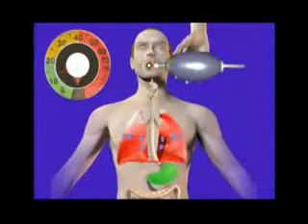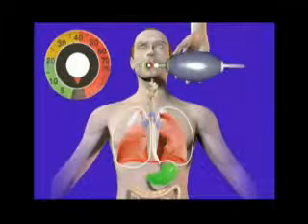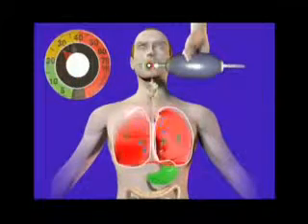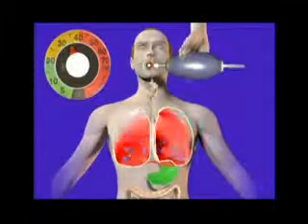Numerous articles suggest that barotrauma begins at pressures greater than or equal to 35 centimeters of water. Use of an integrated pressure manometer allows a clinician to avoid dangerously high delivered pressures.